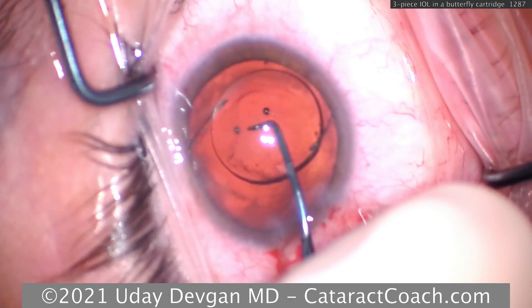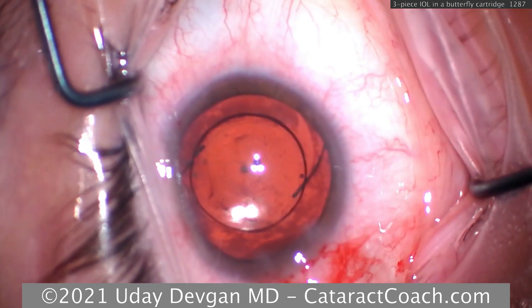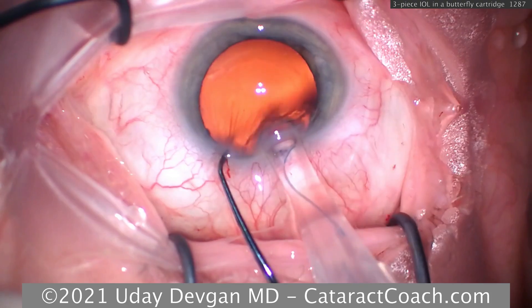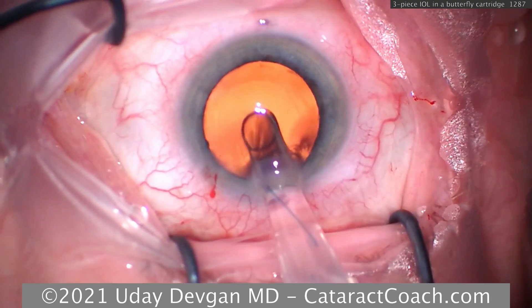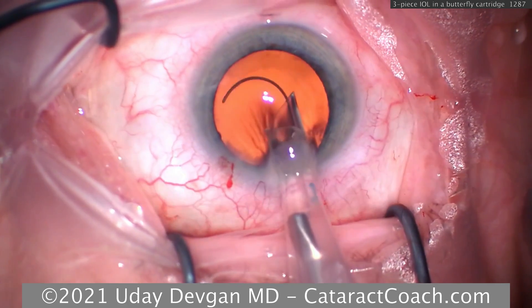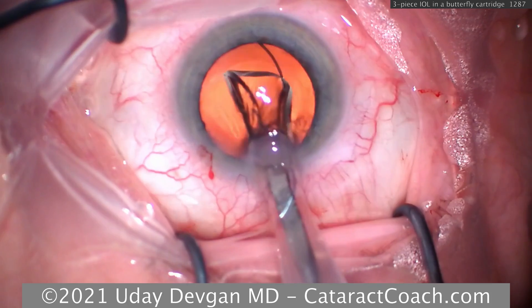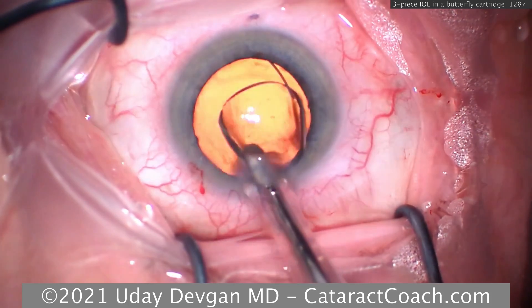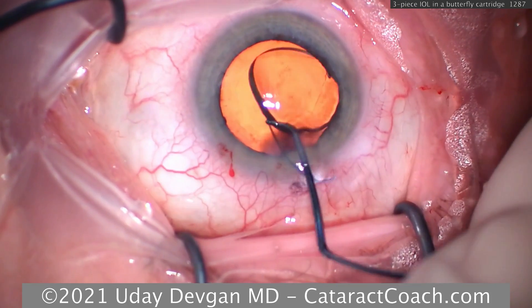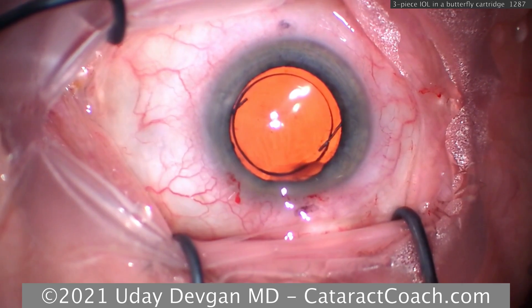Use a chopper to dial it into the capsule bag — keep it very accurate. Sometimes these lenses can come out of the injector misoriented. Here's another patient — a very high myope — receiving one of these ultra-myopic lenses. The leading haptic orientation is not the number seven, so twist the whole injector over — it almost looks upside down — to make sure the leading haptic comes out like the number seven. Flip it back; there's more hand movement and twisting of the tip than you'd imagine, because of how it loaded in. But knowing the 7L rule, we can control it, and now the haptics are correctly positioned in the eye.